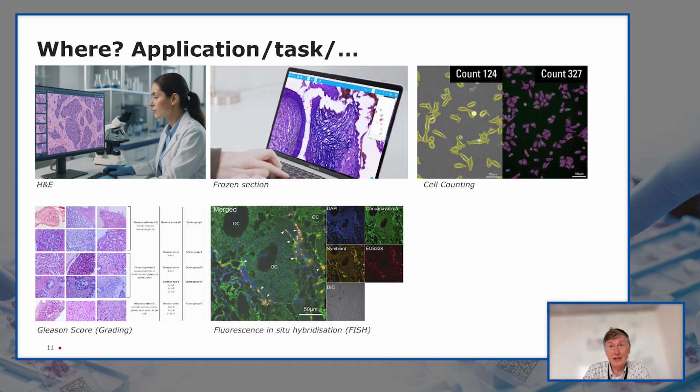So looking to the primary monitor, the medical grade monitor that a pathologist is using on a daily basis to take decisions, life critical decisions, looking to H&E and IHC slides mainly, or images. That's of course the standard way of working.